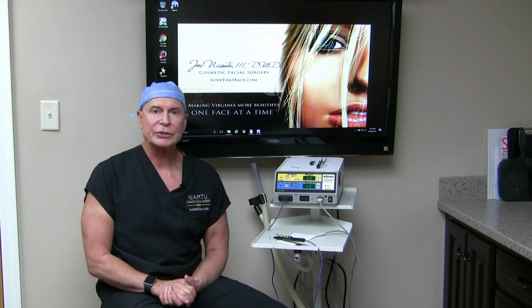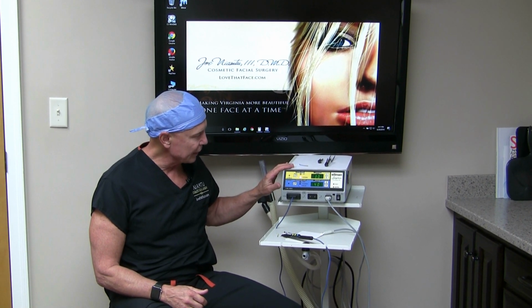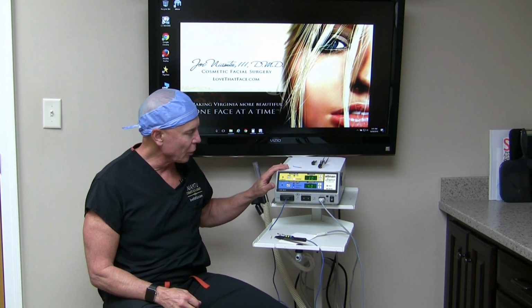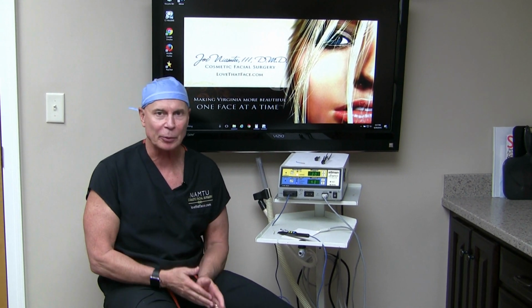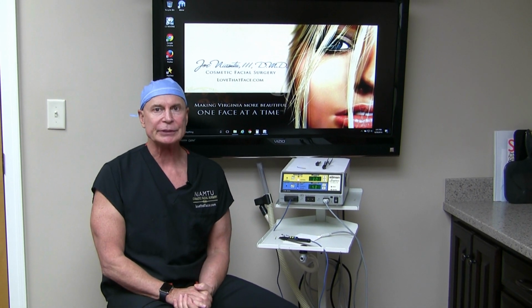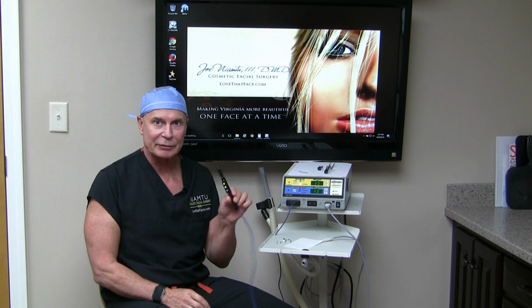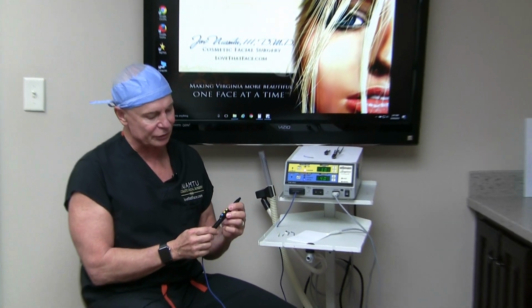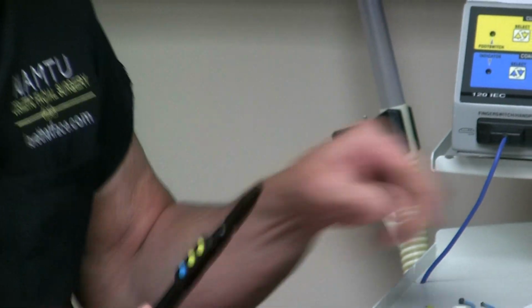Okay, so what we're going to do is talk about the Ellman, and this is one of the 4.0 megahertz dual radio frequency machines. They have different machines and they upgrade them frequently, so you may or may not have this machine, but the theory and principle is the same with all of these machines. So basically you have two things. You have your active handpiece, which usually has 3 buttons unless you have a foot pedal. It's cut, blended, and coag, or hemo.